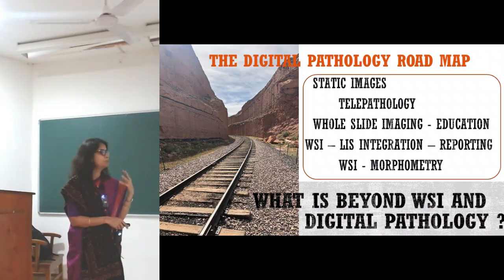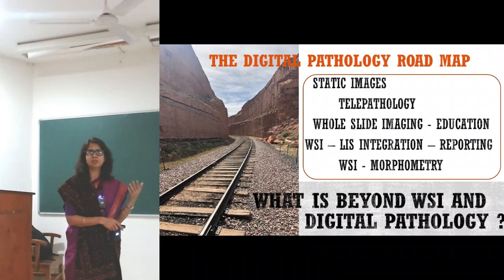These are very preliminary computational techniques which we were using for research, and basically it was more for education and research. This is known as whole slide imaging and digital pathology, and it didn't really take off. It's been there for decades, but it was expensive, the pathologists still had to come to work, so it wasn't making a big difference from what the microscope was doing for us.